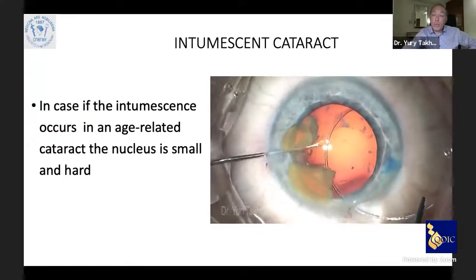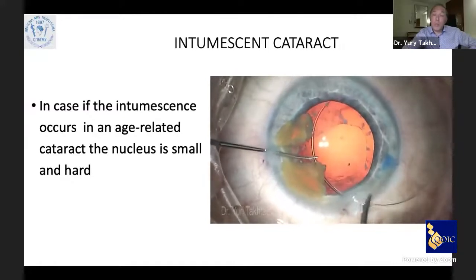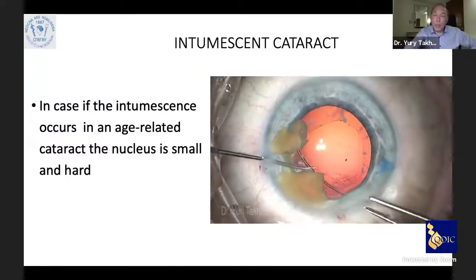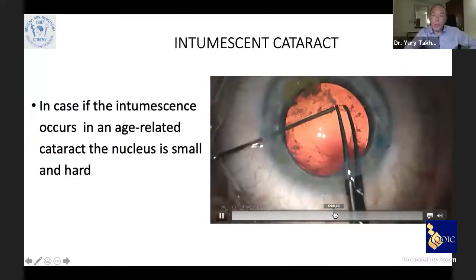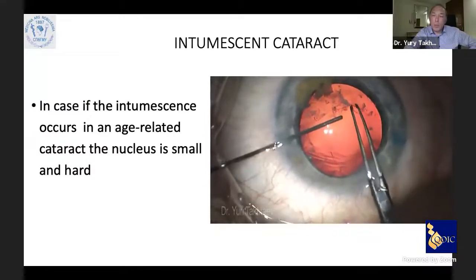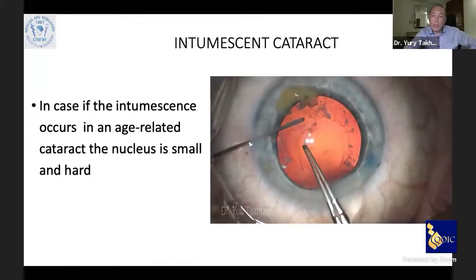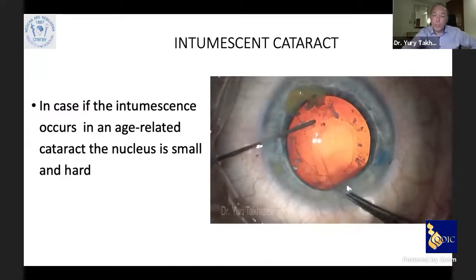Nice, very gentle. I already explained that even if you put the CTR, the posterior capsule and the capsule are very floppy, and there is a high risk of damage to the capsule. In this case, we have the same problem with the posterior capsule. I'll show you at the end. This is the capsule defect, and we also try to round this defect and perform a primary rhexis just to keep the capsule back for the in-the-bag implantation.